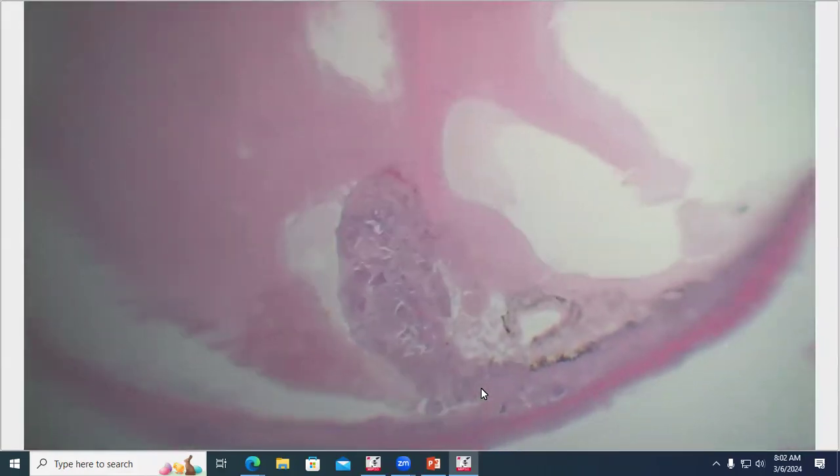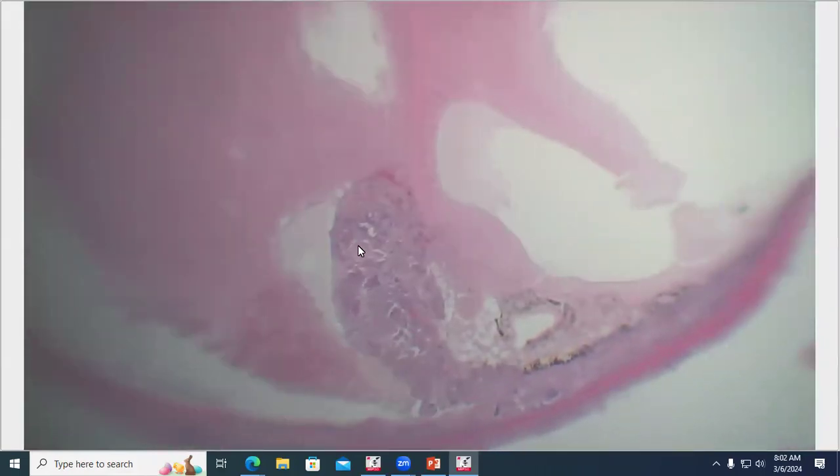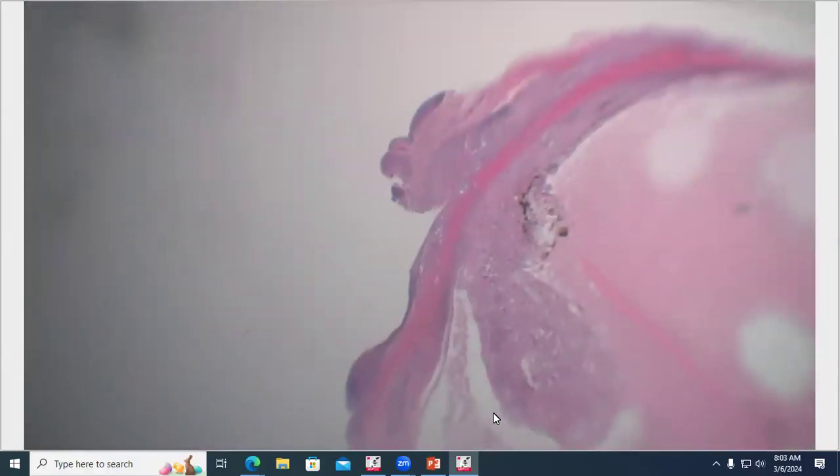Okay, so here's our cornea. It's quite busy, so there's quite a bit going on there. And then as we move back into the globe, you can see that tan flocculent stuff that we saw in the gross photo corresponds to this pink dense stuff. When we look at the iris here, it is expanded as we saw grossly, and it is also quite busy. So there's quite a bit going on in the iris stroma that does extend back into the ciliary body a little bit on both sides.